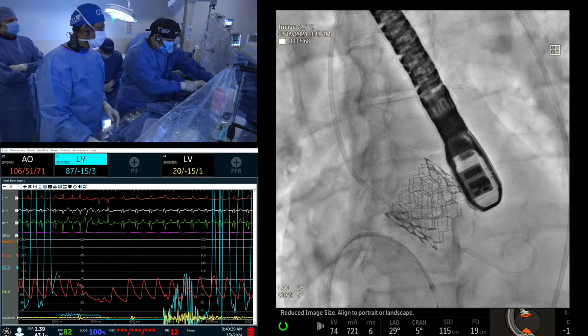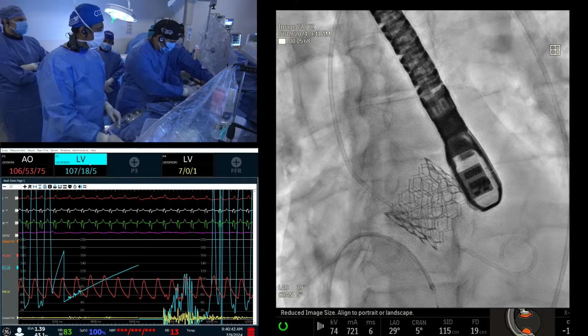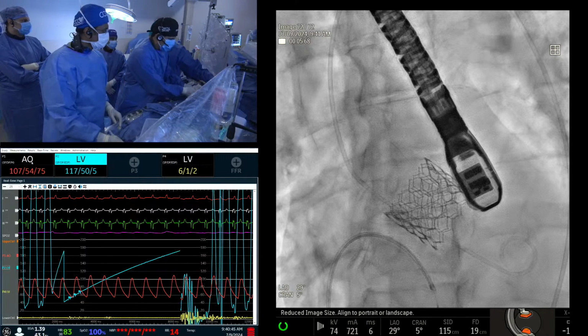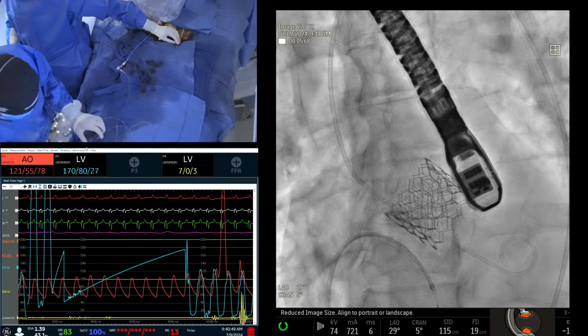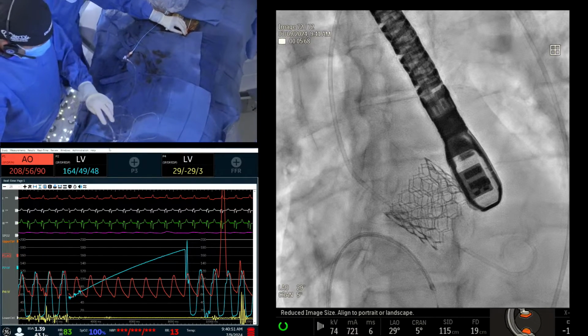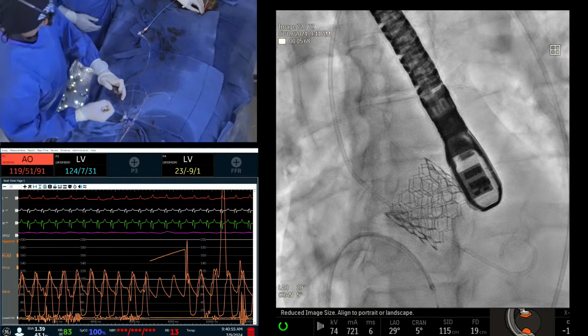If you're 2 millimeters down, I can do it. The whole point was, are you 2 millimeters down? It looks like you're 2 millimeters down. But even then, 4 millimeters, where was the PVL? You can see the second valve never foreshortens the same way as the first valve. That's true. And we picked the right valve by 23. 26 will be an even bigger problem, so that's why I switched.